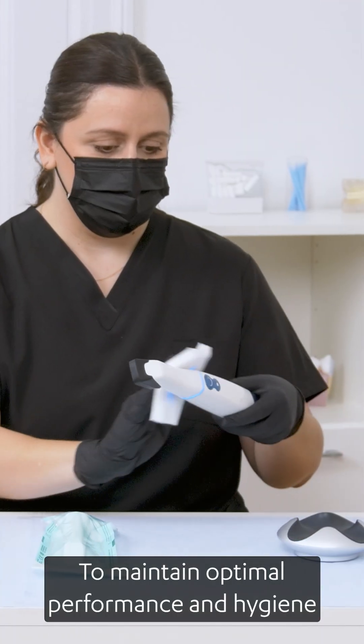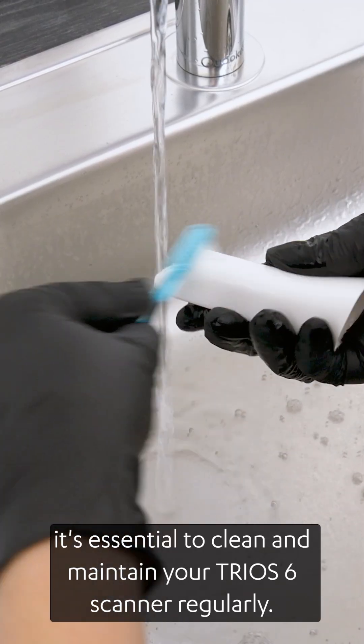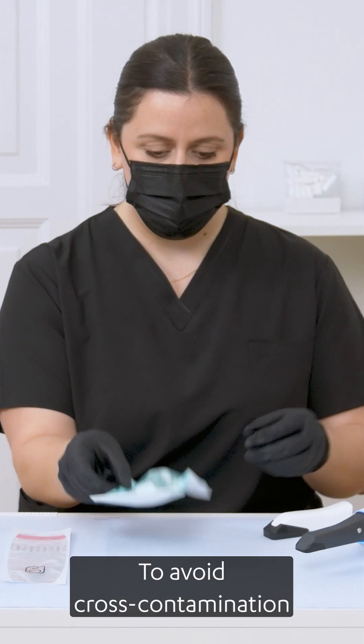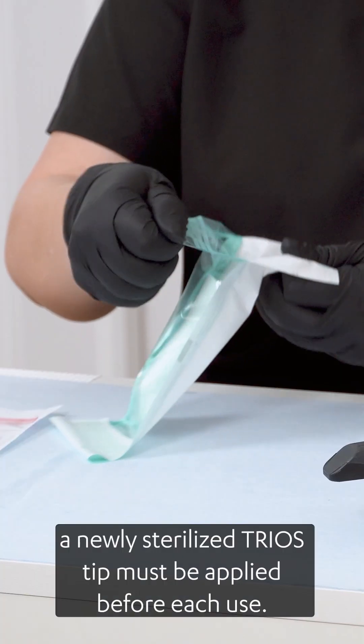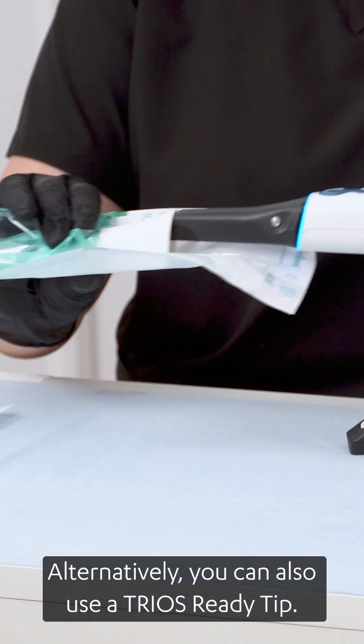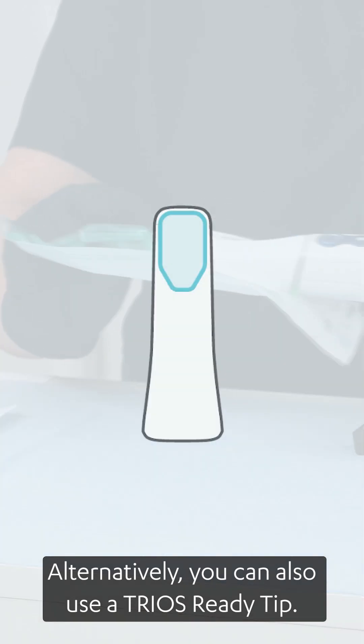To maintain optimal performance and hygiene, it's essential to clean and maintain your TRIOS 6 scanner regularly. To avoid cross-contamination, a newly sterilized TRIOS tip must be applied before each use. Alternatively, you can also use a TRIOS Ready tip.